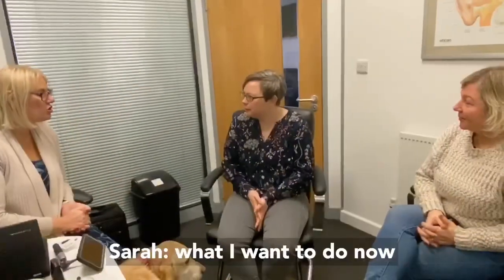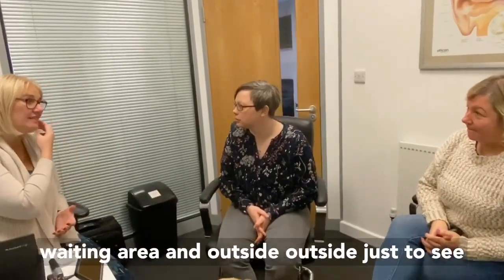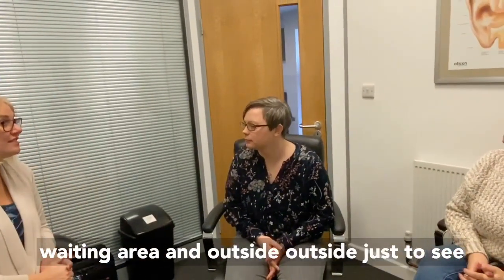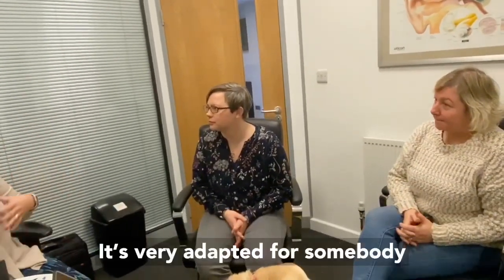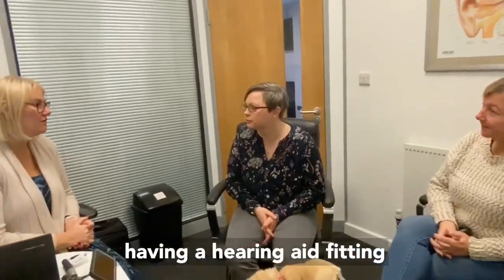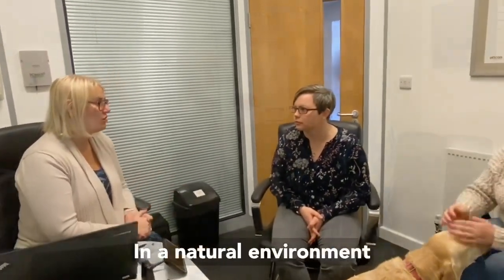11 beeps. What I want to do now is I want you to go outside into the waiting area, just to see something more natural, because in here it's very soundproofed, it's very adapted for somebody having a hearing aid fitting, but I want you to experience what it's like in a natural environment. Go outside.